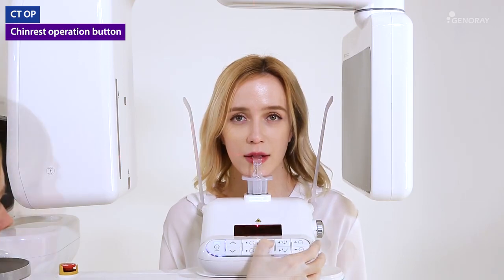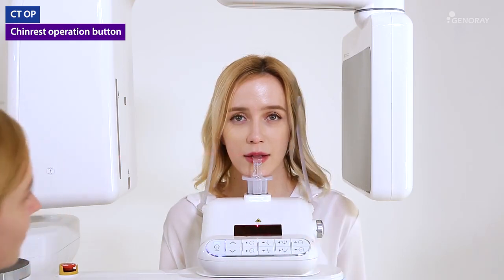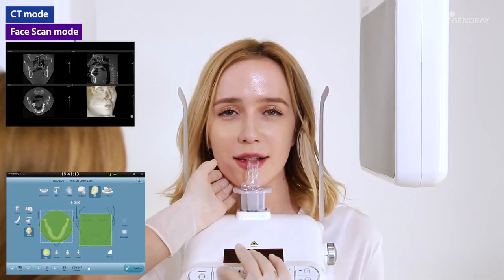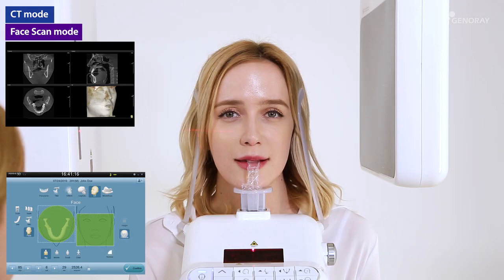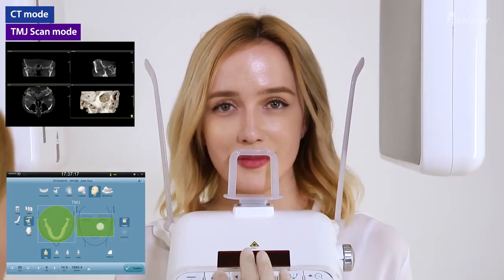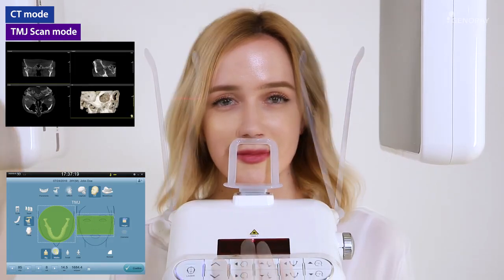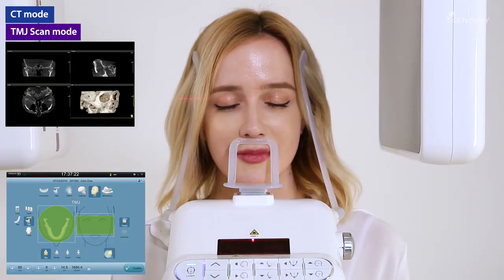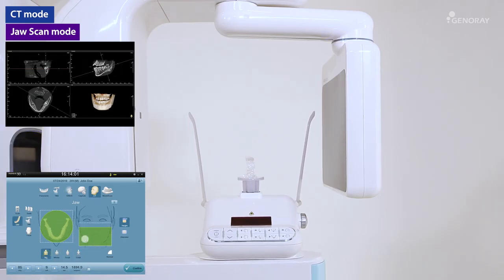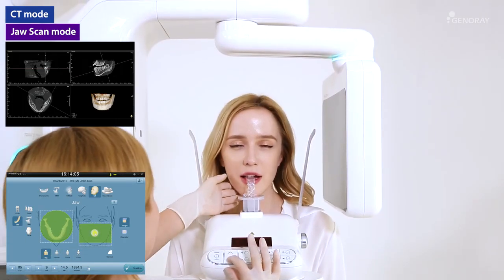If necessary, use the chin rest operation buttons to adjust the correct position. After the initialization is done, guide the patient for the position and the bite stick. According to the scanning area, the system will automatically adjust the chin rest position.